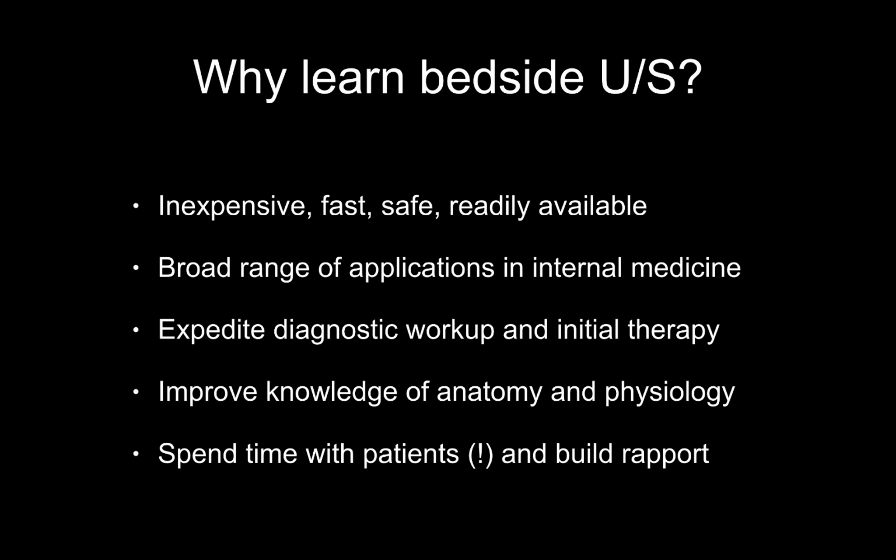There's a number of reasons why bedside ultrasound has been gaining in popularity over the last 10 years. It's inexpensive, it's fast, it's safe to our patients, doesn't involve any ionizing radiation, and more, it's readily available at the bedside. As I hope to show you in the next slide, it has a broad range of applications in internal medicine. In many cases, it can help us expedite our workup and even guide initial therapy for our patients.